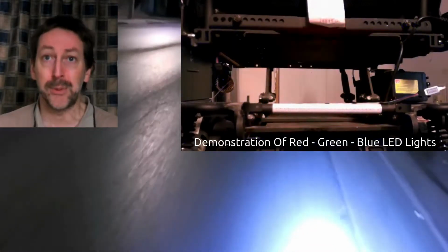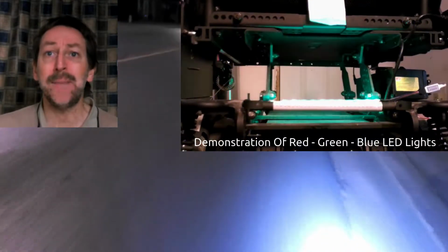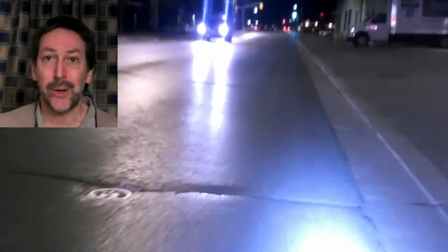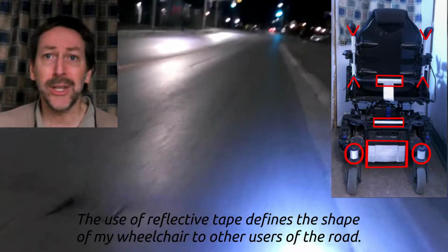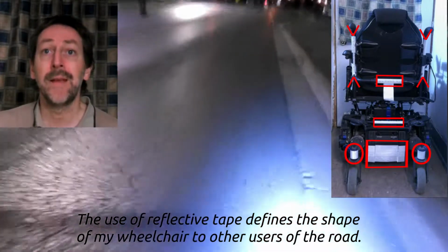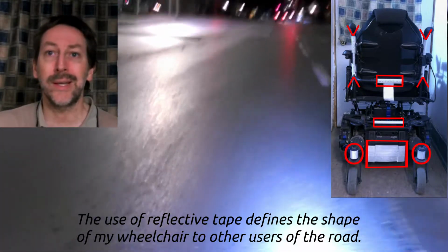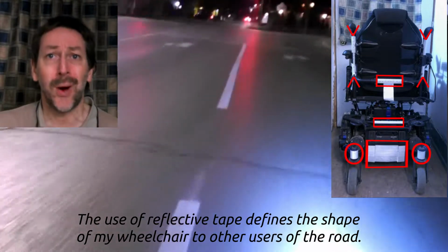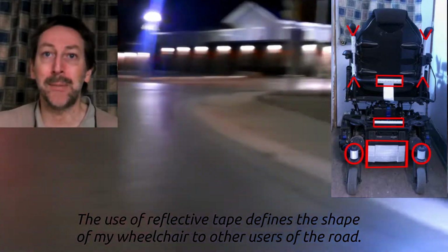Another thought, and what I'm pursuing, is adding a different set of LED lights. These ones are strip lighting added to the frame of my wheelchair so that cars behind me can see me better. There will be a clearly defined shadow from the white lights aiming forward that cars will see me from, but I can do better than that. The procedure is applying white reflective tape to the wheelchair, and then applying the strip LED lighting around or over top of that. The thought behind it is that the reflective tape will give me more light for each watt that the battery uses. It's getting the most bang for the buck in what I'm able to do with this.